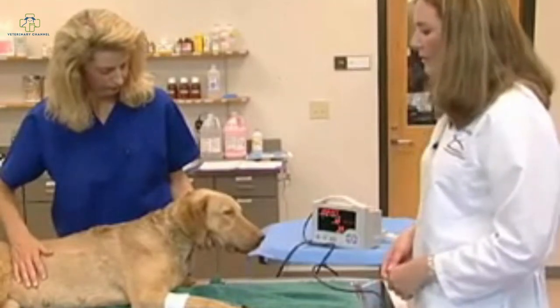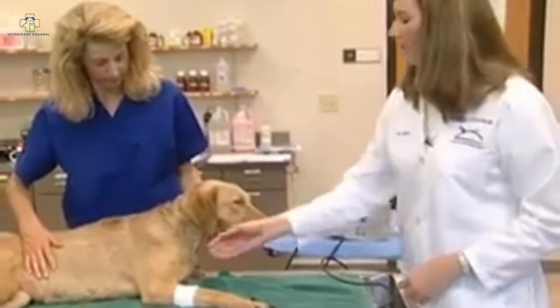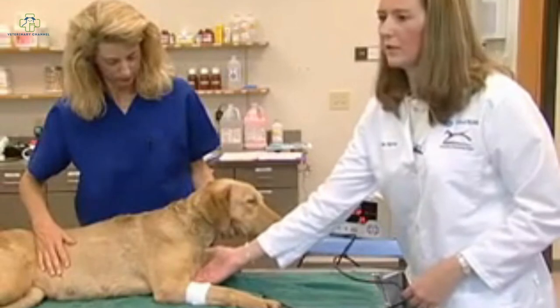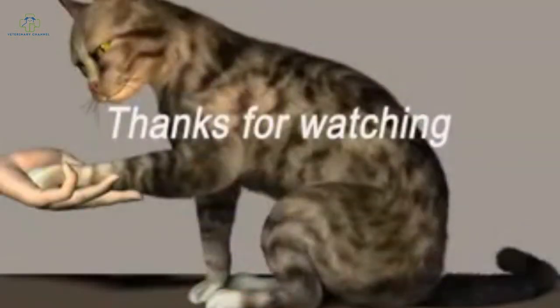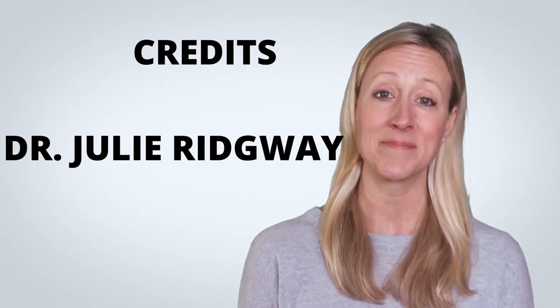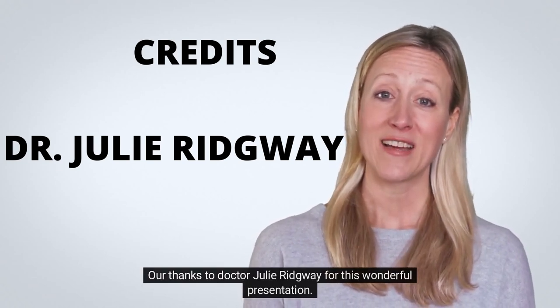In cats, it's sometimes best to measure the pressure above the elbow with the tube coming down the cranial lateral aspect so as to be completely over the artery. In these cases, it can help to have the cat in a sitting position with someone extending the elbow out. Our thanks to Dr. Julie Ridgway for this wonderful presentation.